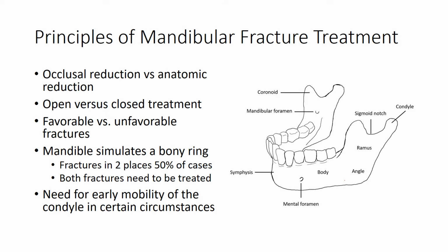Finally, this may be too advanced and maybe I shouldn't even mention it, but it relates to treatment and it does affect how you'll view these images, particularly post-operative images. There is the concept of the need for early mobility of condyle fractures. So if you have a fracture of the neck of the condyle or even subcondyle, the thought is that you don't want to have that condyle not be moving for 6 weeks.